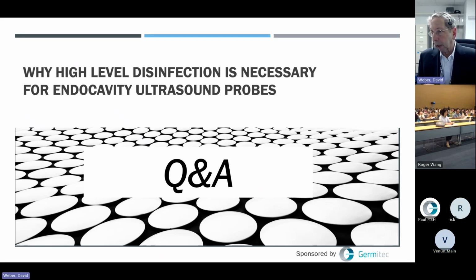So ultraviolet light has been widely used in medicine for years in many different venues. Most commonly, it's been used in large ultraviolet light machines for terminal room disinfection, as a supplement to standard cleaning. It's widely used in the US, Europe, and many other places because studies have repeatedly shown that environmental service workers don't touch every surface with a chemical, leading oftentimes in 30 to 50% of the time to continued pathogens in the room.